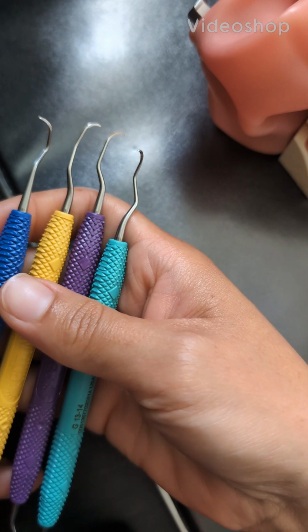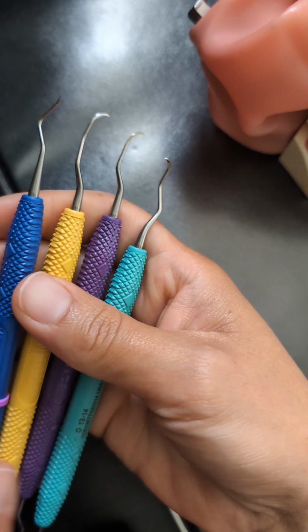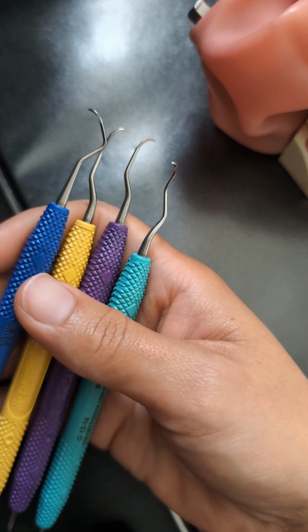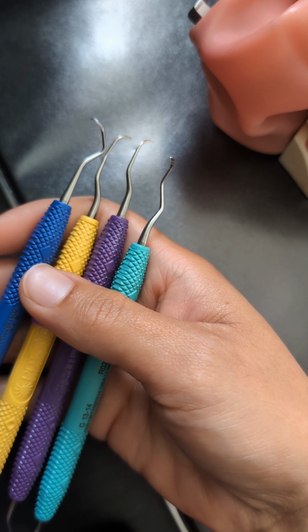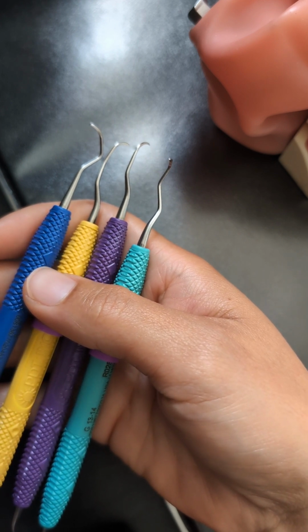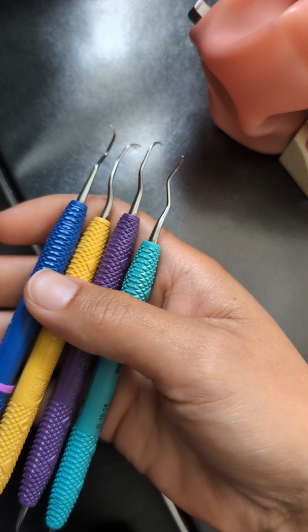The universal and area-specific curettes are indicated for scaling and root planing, supragingival and subgingival calculus removal. Contraindications would be for patients with bleeding disorders or patients that are taking anticoagulant medications. There is risk of excessive bleeding. Also, for patients that have implants, there are special instruments for implants. And also for acute infections or abscesses, we should avoid using these instruments.